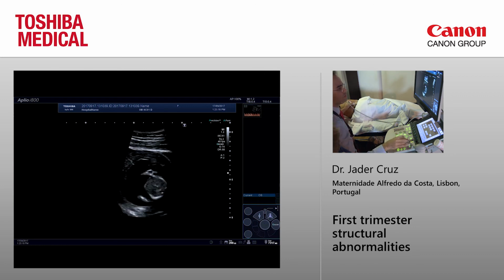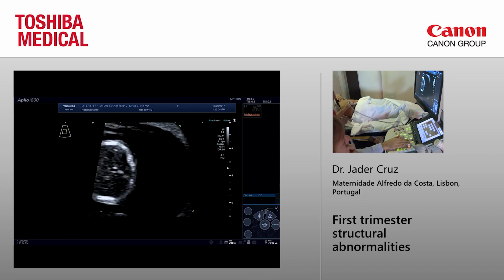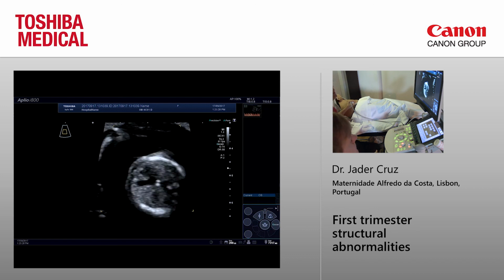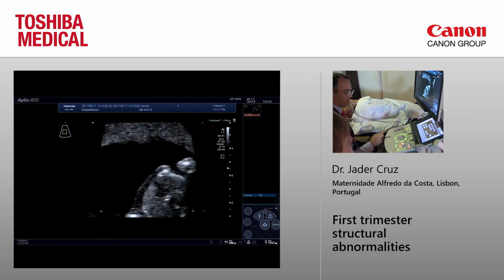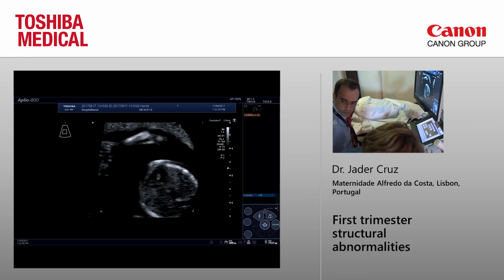Why measure the ductus venosus PI at 12 weeks? Isn't just the waveform the most important thing at 12 weeks? No. For heart assessment, the A wave is important.